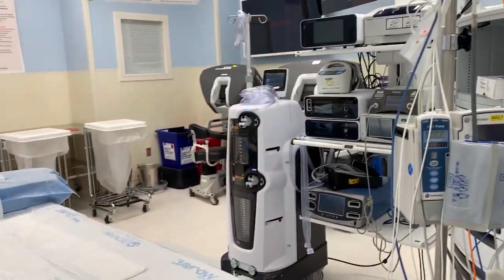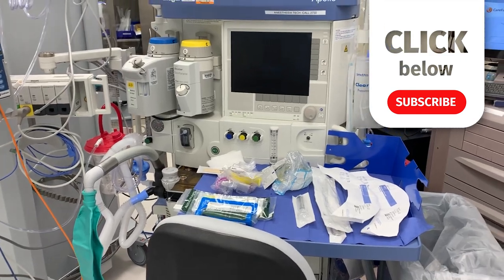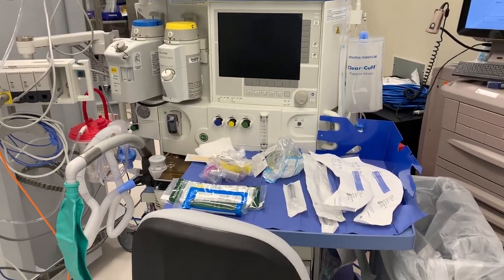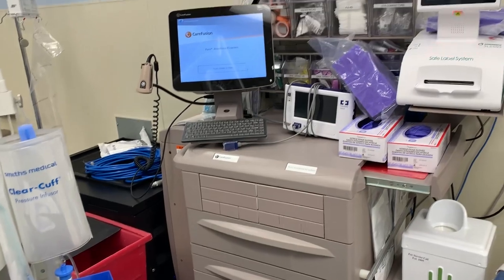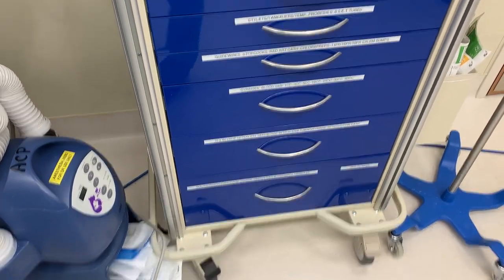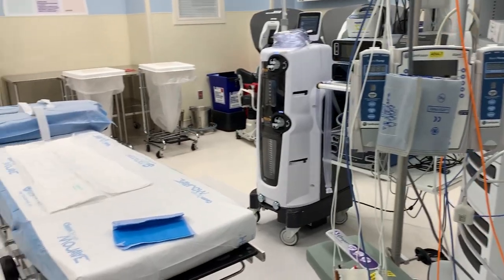So here we are in one of our main ORs. This is a room that we usually use for many different types of surgeries. So we have a bunch of equipment in here. Most importantly, we have our anesthesia equipment, our machine, all of our basic supplies for setting up, medications, and other accessories, which we have in a cart here that we will use pretty frequently to give anesthesia and to monitor patients. So that's what we have going on here. And then there's a whole bunch of other stuff.